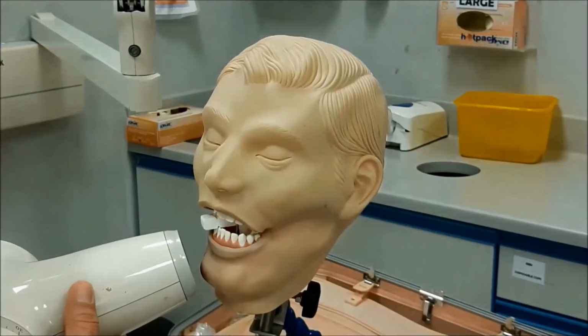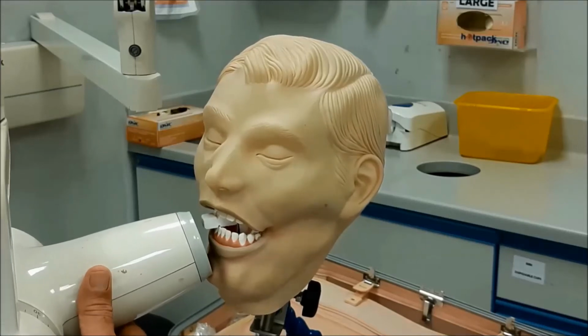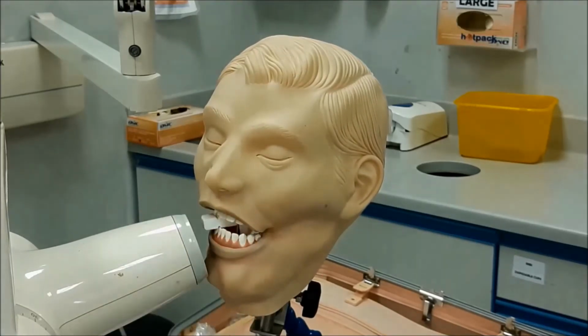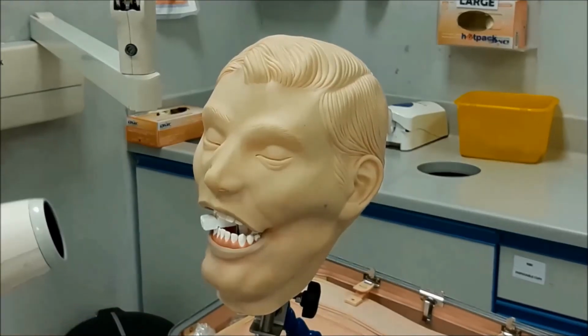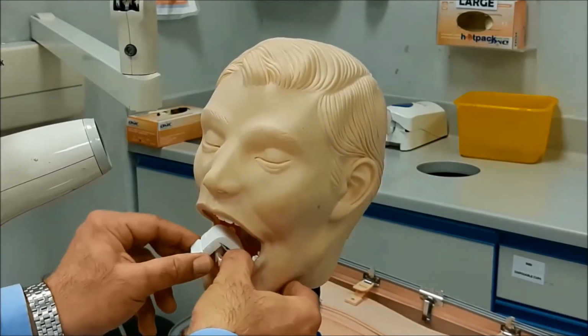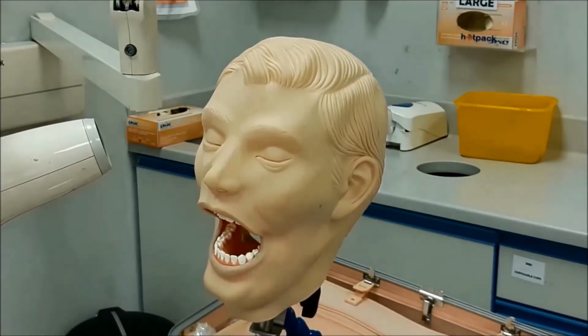To prevent cone cut, I will just make this flush with the outer border of the position indicating device, or what we call the cone. Okay, very easy to use. So take this out once you're done. Ask the patient to open and then remove the film out of the oral cavity.